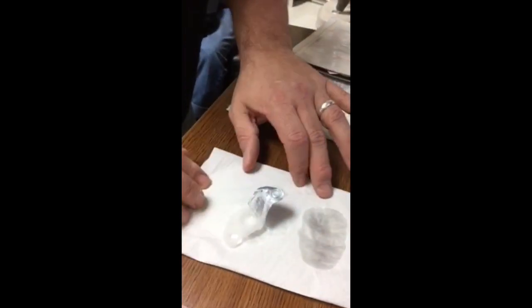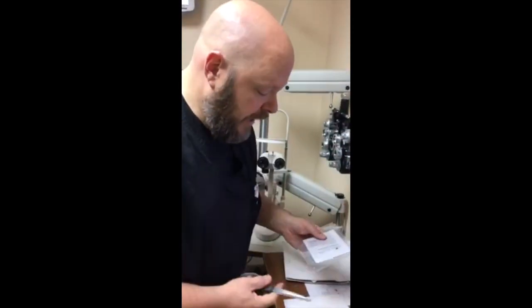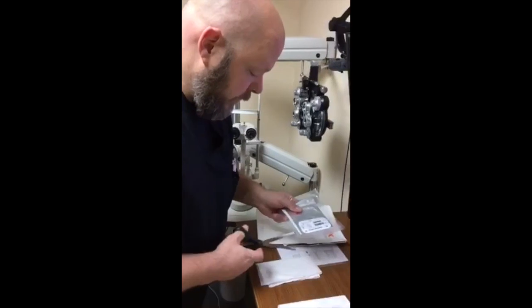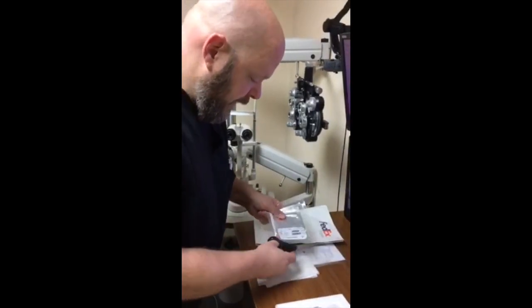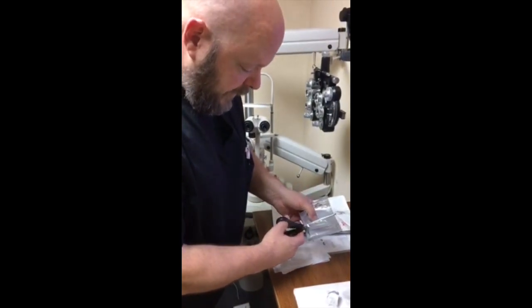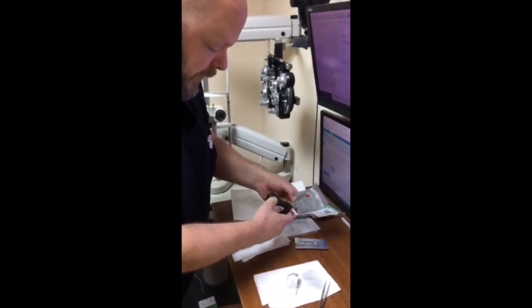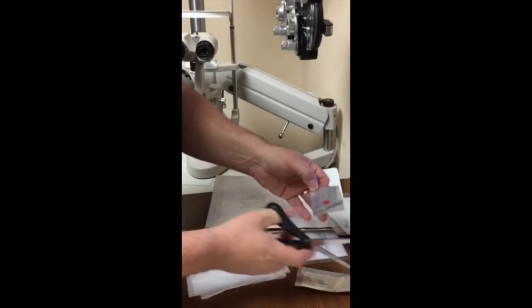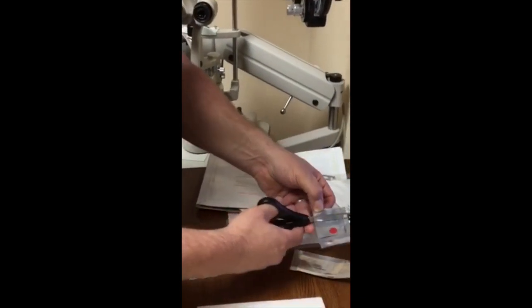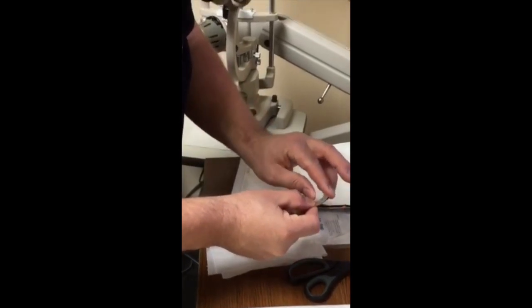This is after we have cleaned our hands and prepared the patient by putting two drops of anesthesia in the eye — one in each eye — so that they're comfortable. We then remove our membrane from the packet. I cut my package open while keeping my finger on the membrane, because it's a very expensive mistake when that membrane flies out.